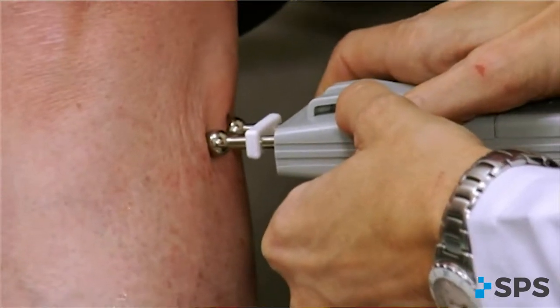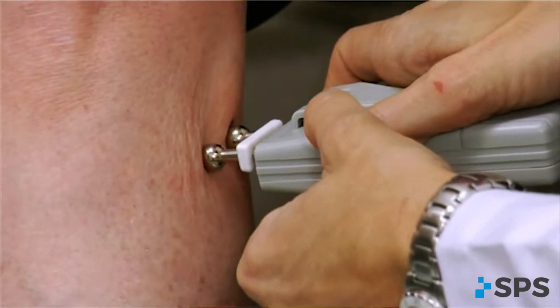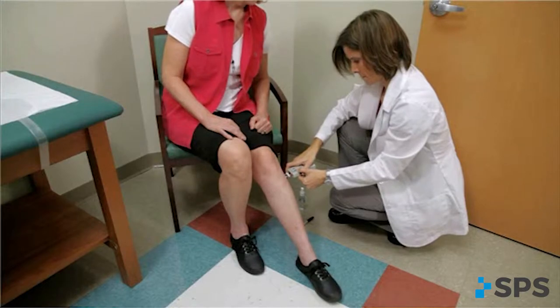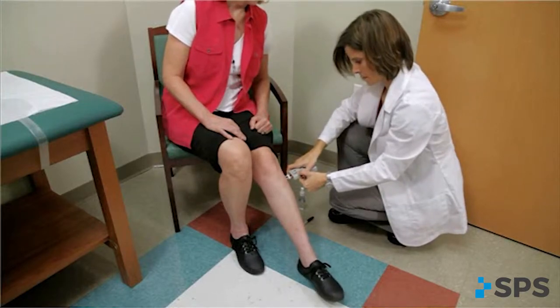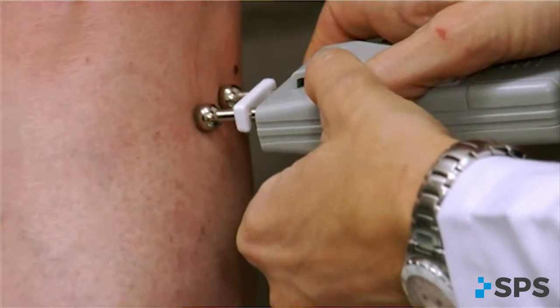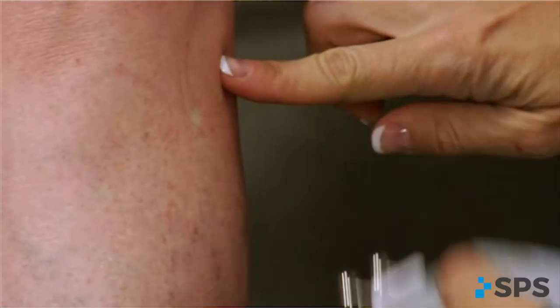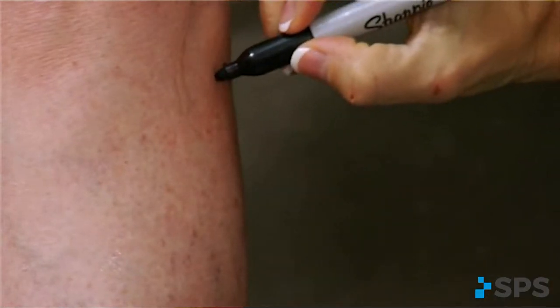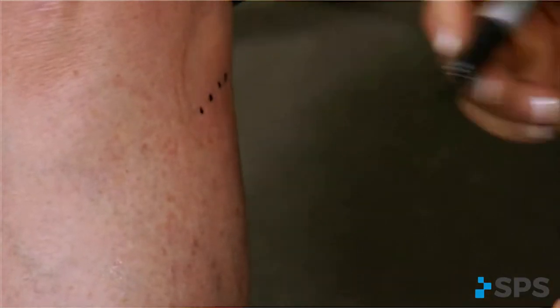You can track the deep peroneal nerve pathway by moving the mini stim anteriorly. Watch for dorsiflexion as you move slowly. You may need to increase the intensity to drive the stimulation through the muscle to the deep nerve. Identifying and marking this pathway will outline where you can move the electrodes to facilitate dorsiflexion.